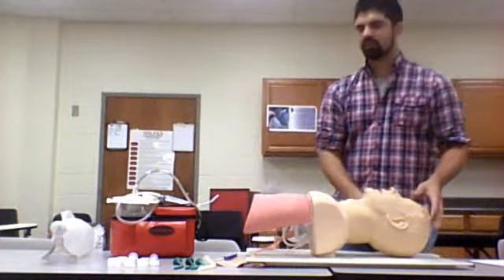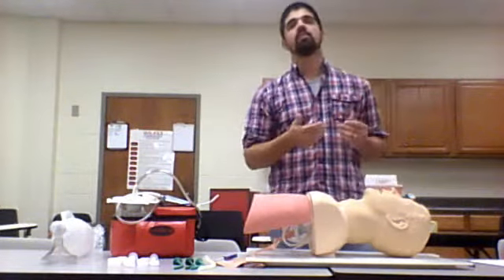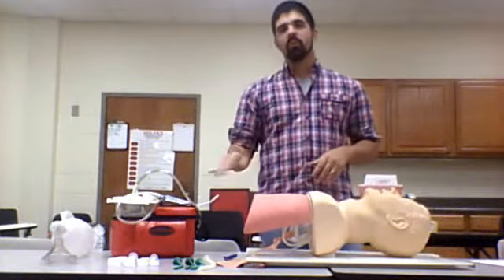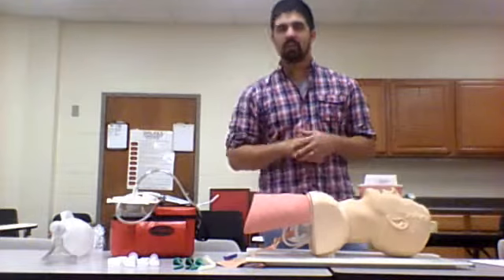So, when do we use this? Well, this is an apneic patient. Our patient is unconscious. They're apneic, meaning they're not breathing, so we need to breathe for them. And at this basic level, we're going to use these adjuncts with the BVM and suction as needed to help control the airway and oxygenate.